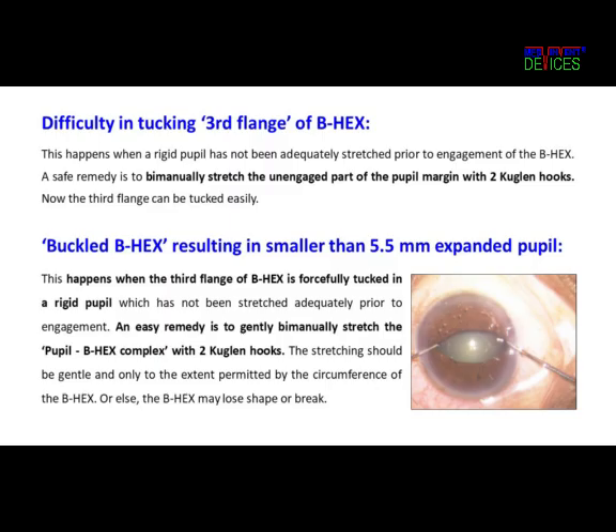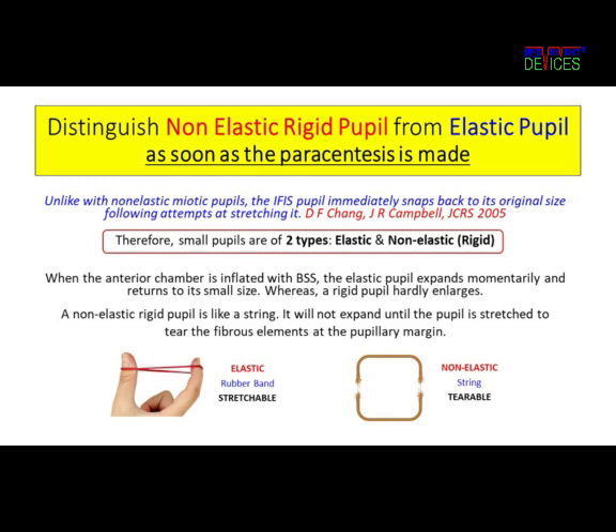If we have a pupil that looks smaller than 5.5mm, we must suspect a rigid pupil and a buckled B-Hex. Stretching the pupil-B-Hex complex with Kuglen hooks will easily resolve this. To conclude, it is necessary that we distinguish between the elastic rubber-band-like pupil and the rigid string-like pupil at the first opportunity after we have made the side ports. A rigid pupil smaller than 4mm needs to be stretched before using the B-Hex pupil expander.